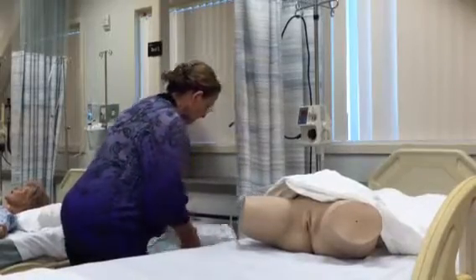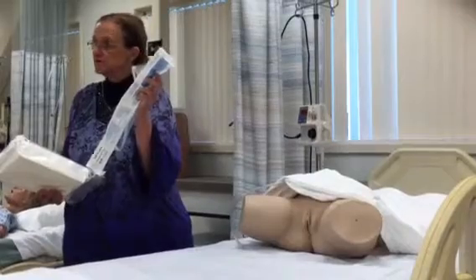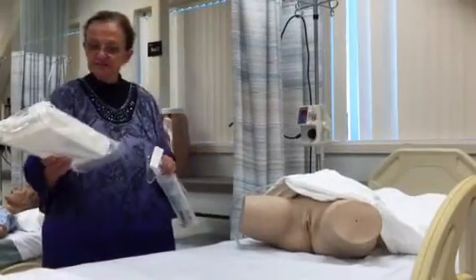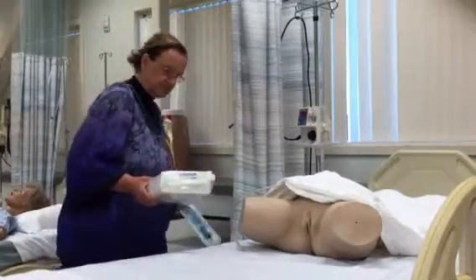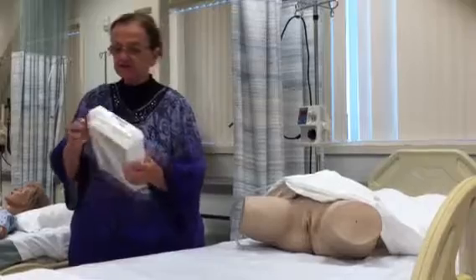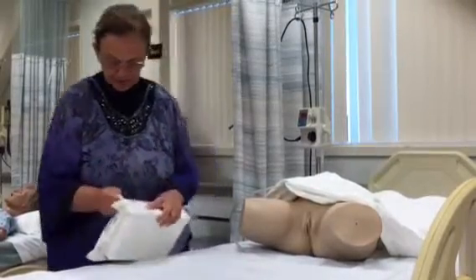I have also brought myself an extra sterile catheter in case I contaminate, so I have my plan B with me. But in most catheter kits, the catheter kits actually come in the tray. This happens to be a Foley cath tray. Everything should be in here. And so I'm going to go ahead and open it up.